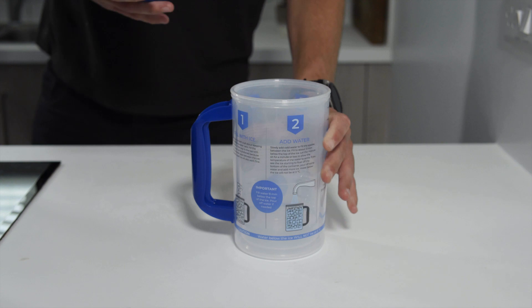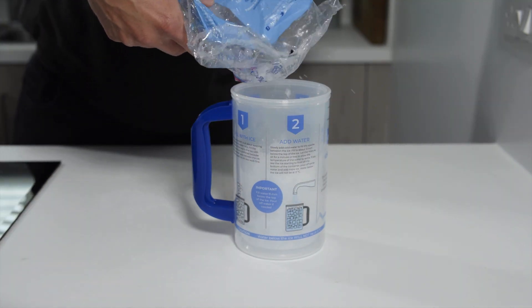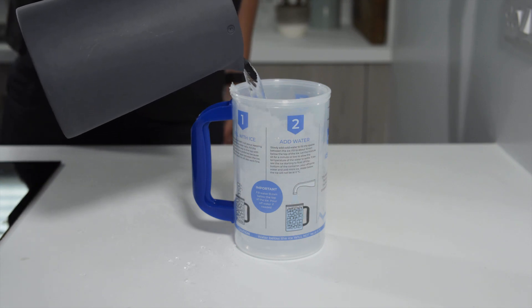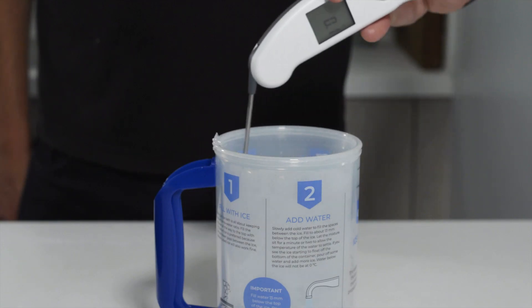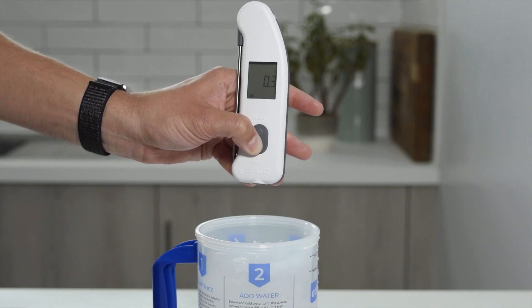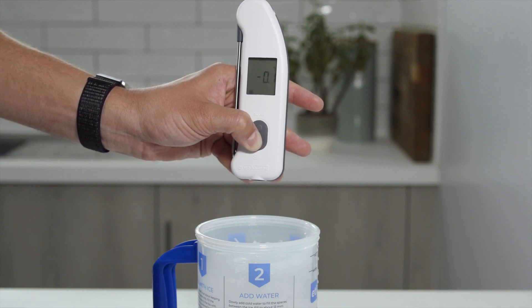An ice bath is the cheapest and easiest way to calibrate a temperature probe. However, creating an accurate ice bath that is precisely 0 degrees C is pretty tricky, so using this printed ice bath mug makes things a little bit simpler. Preparing an ice bath takes time and it won't stay accurate for long. However, if you aren't required to check your thermometers regularly and you only have a small number of thermometers, this could be the best option for you.